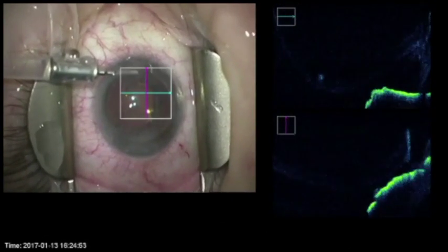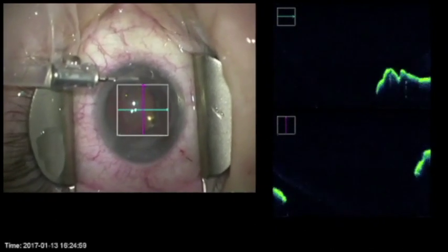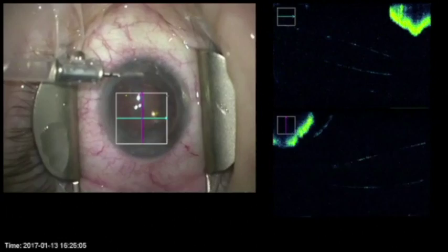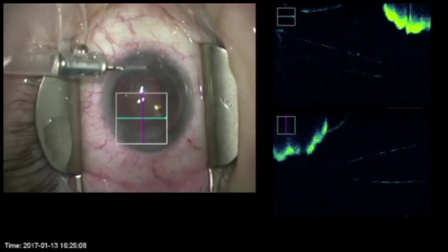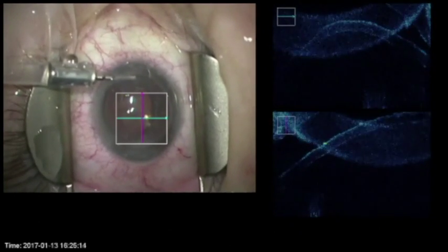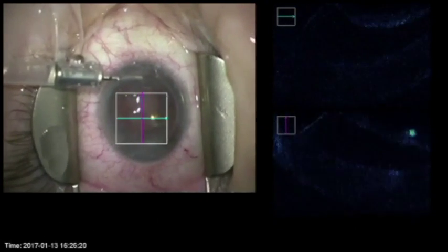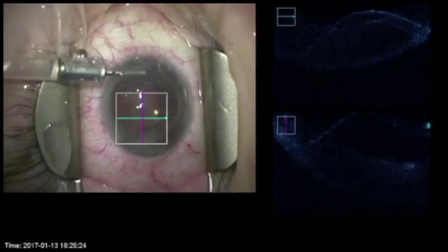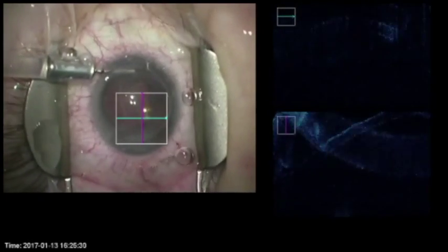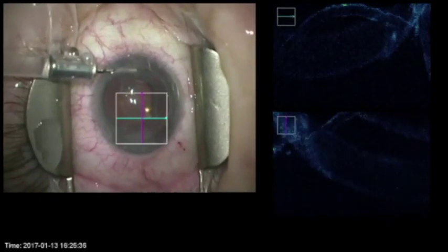Align the OCT device so that I can see the recipient cornea and the donor graft. Right now we're seeing bits of the iris. Now the donor graft is coming into view. The focus can be done by an assistant, but also done at the microscope foot pedal, which is very nice. You can now see the separation of the recipient and donor grafts.